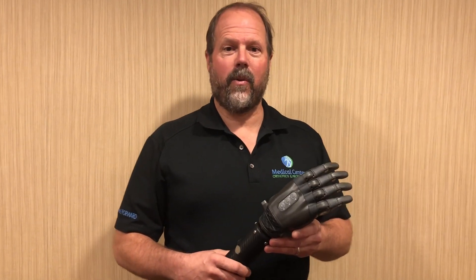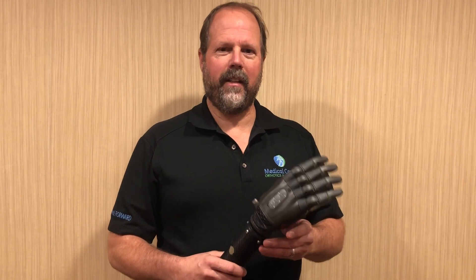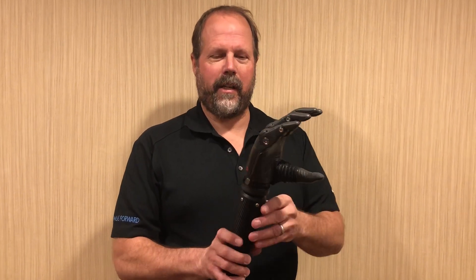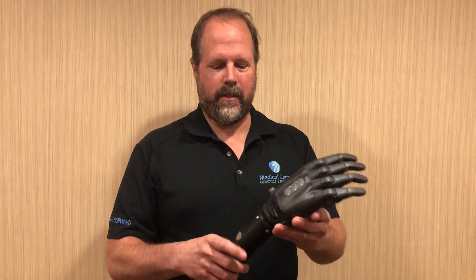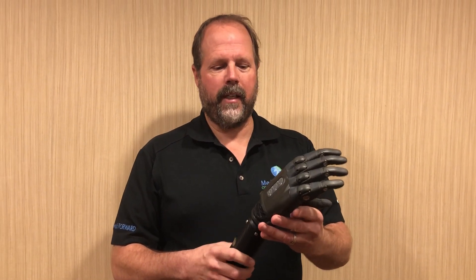Hi, I'm James Vanercy, Medical Center Orthotics and Prosthetics, and today I'd like to show you the Tasca hand by the company Tasca out of New Zealand. This is a new hand to the United States. It's a great multi-articulating hand.